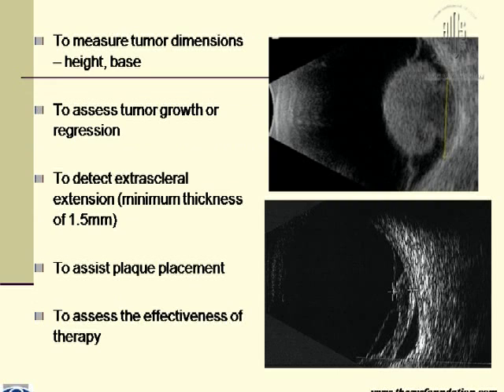Ultrasound is of course extremely useful to get the accurate dimensions of the tumor. We have to measure the base of the tumor as well as the height of the tumor, and these measurements help us to monitor the tumor for its growth or regression during serial examination.